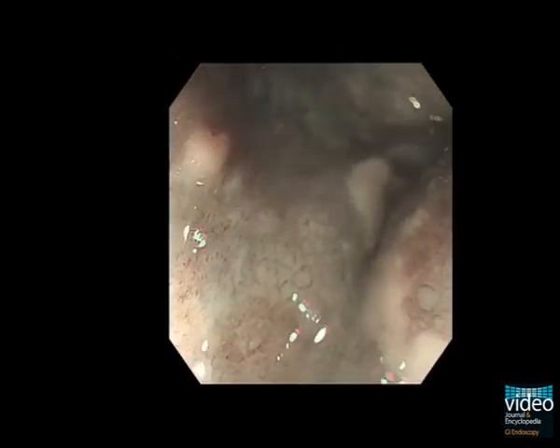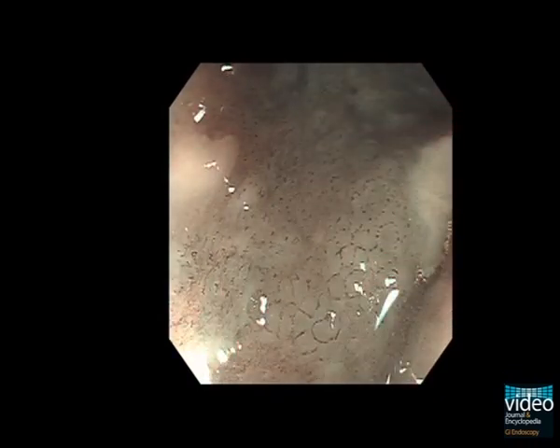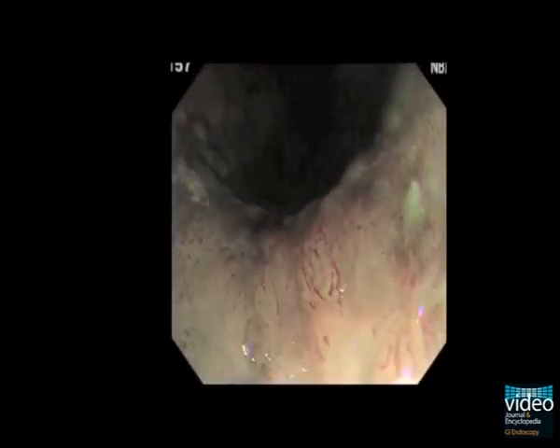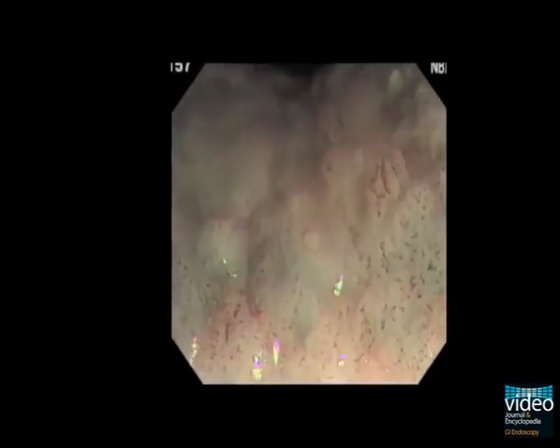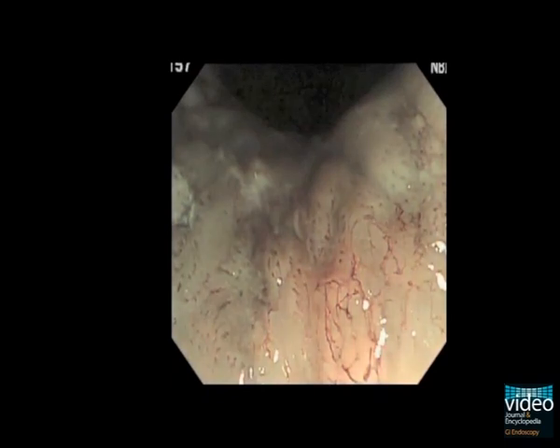Detailed observation of the vascular architecture of esophageal neoplasias by NBI is therefore very important because it can provide valuable information for the diagnosis and prediction of infiltration depth in such tumors.